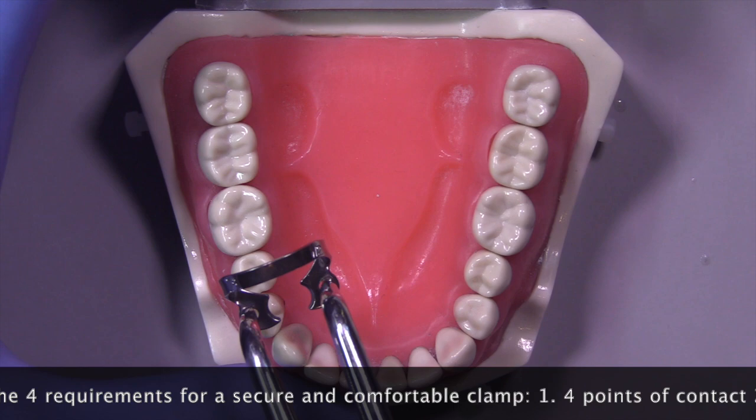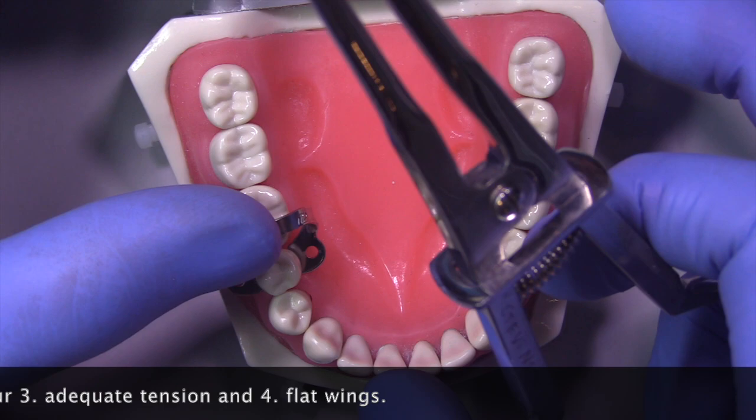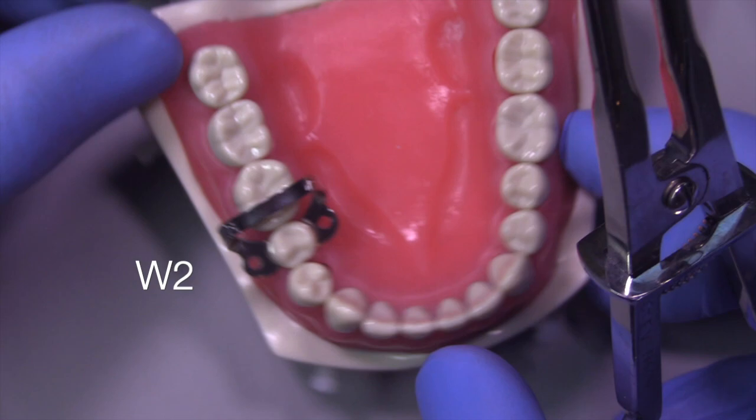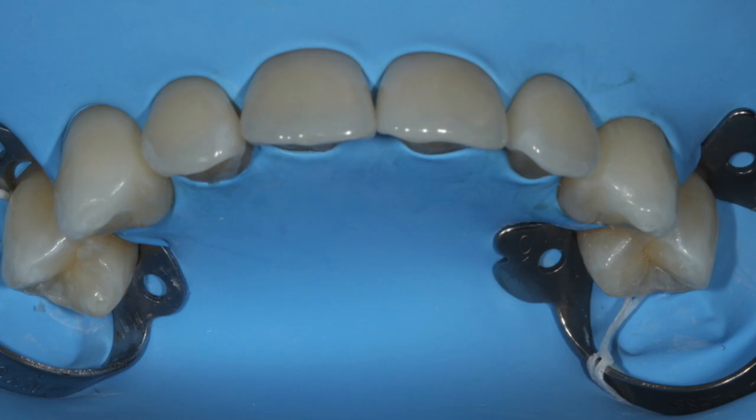The four requirements for a secure and comfortable clamp are: four points of contact, placement apical to the height of contour, adequate tension, and flat wings. The flat wings don't hurt the patient's tissues. You can see in this particular case where I'm using a W2, it satisfies all of those requirements.